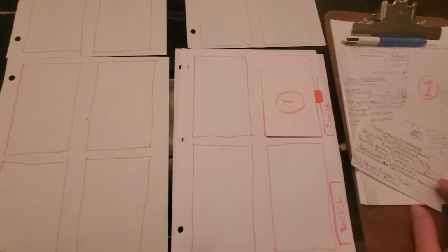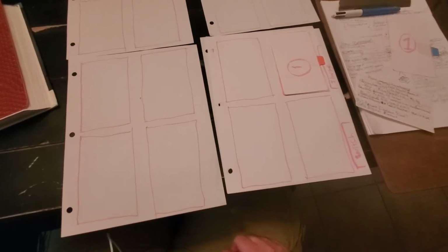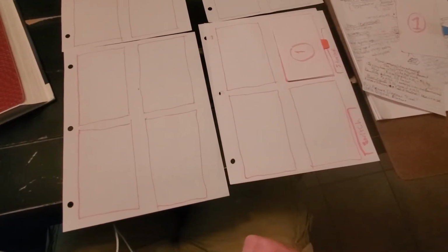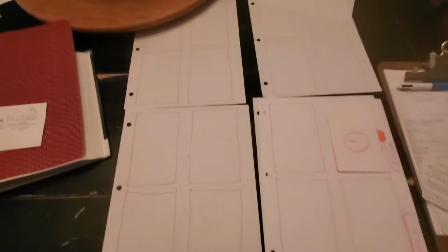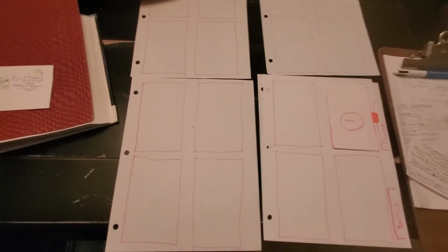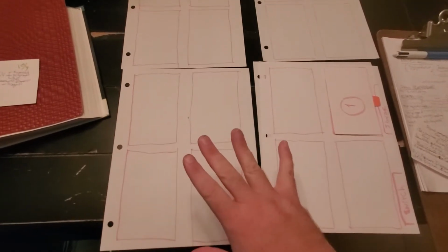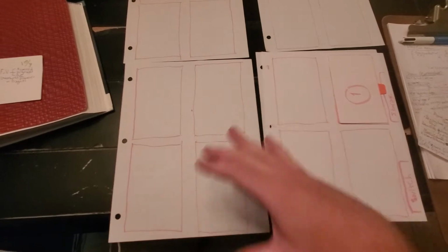Because your field of view can't be larger than your matrix size, since you can't expose more pixels than are in the cassette.